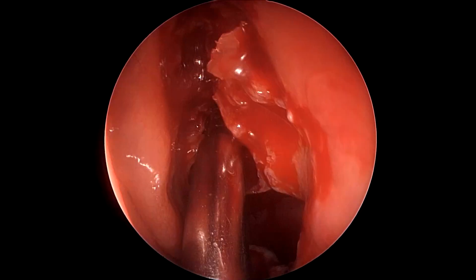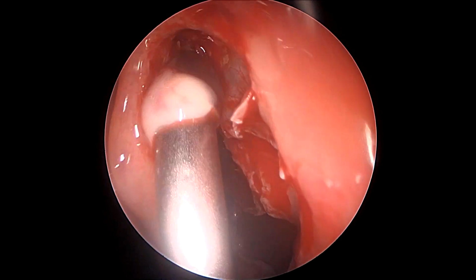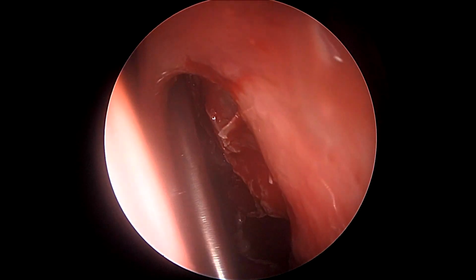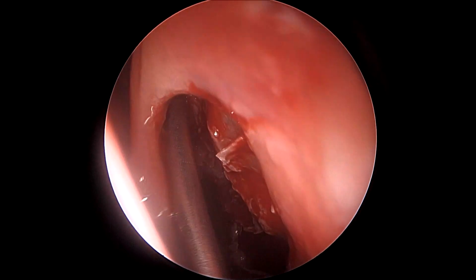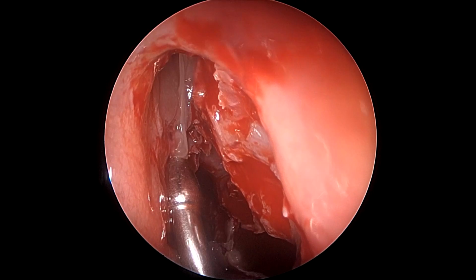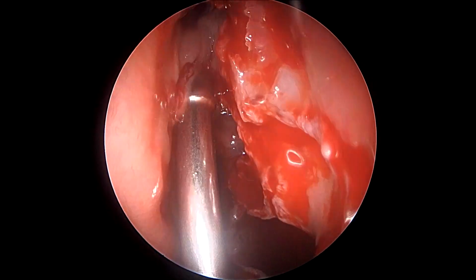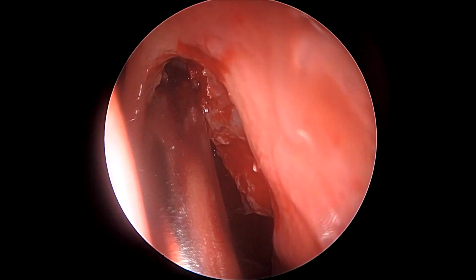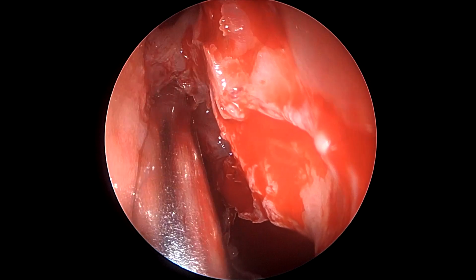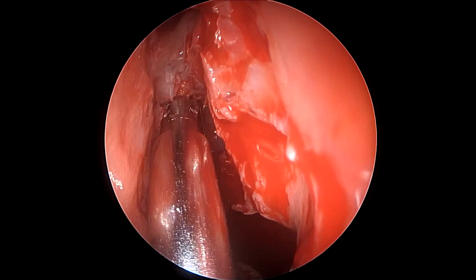Now one can start appreciating the whole 3D anatomy by orientation of the maxillary antrum and its walls with the sphenoid and the ethmoidal complex. Now our suction is an olive-tip suction, the frontal sinus suction. We are trying to navigate our way inside the frontal recess. And we see here there is a considerable amount of polypoidal mucosa, which we are gradually and gently debriding, trying to avoid circumferential trauma because that often leads to sure-shot scarring and possibly restenosis.